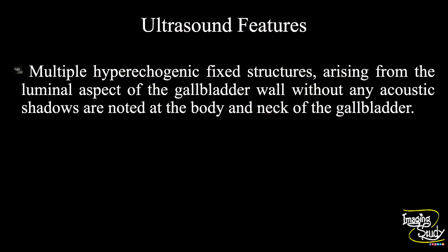So in summary, multiple hyperechogenic fixed structures arising from the luminal aspect of the gallbladder wall without any acoustic shadows are noted at the body and neck region of the gallbladder, suggesting gallbladder polyps.